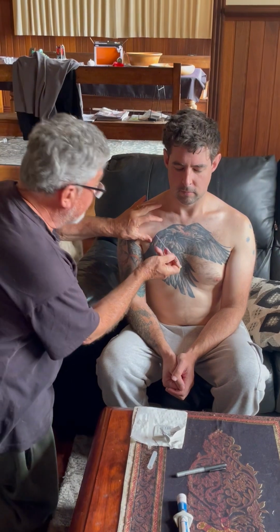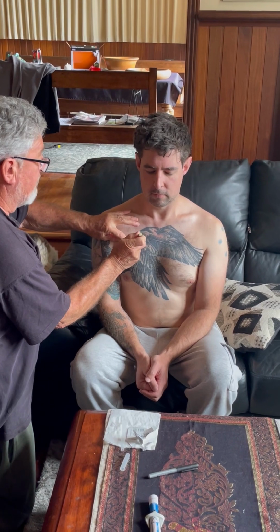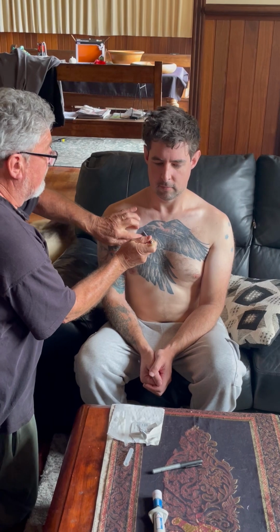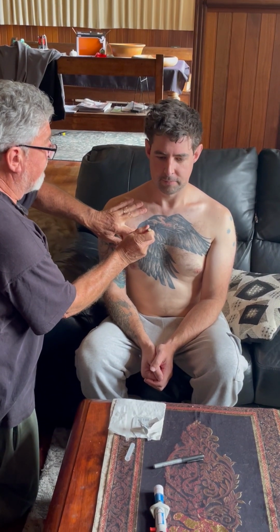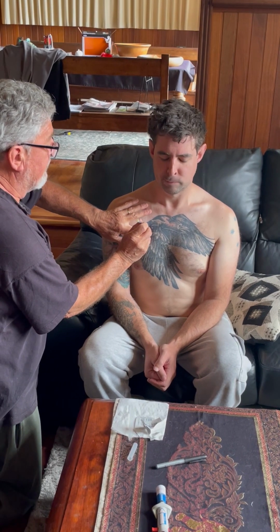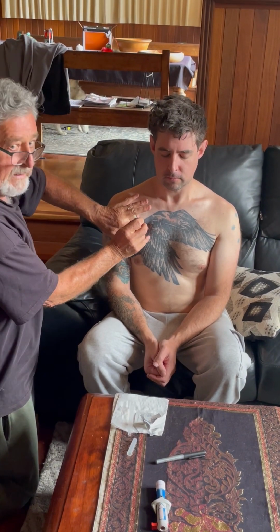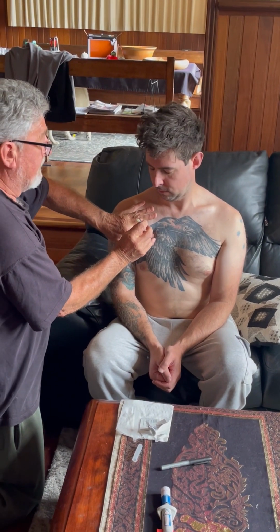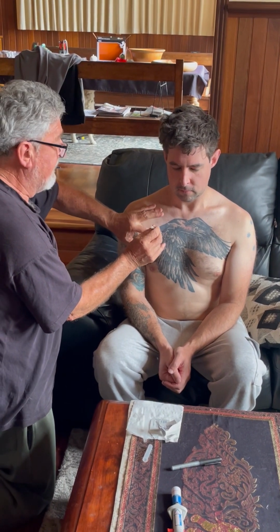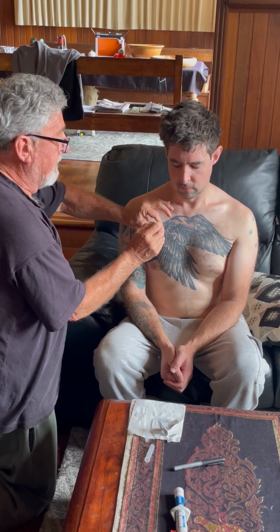So what we're trying to do now is identify where that mark is. We're going to insert the needle perpendicular to the chest, slightly above the third rib, and slightly towards the vertebral body. We insert that straight in until we feel a bit of a give or a bit of a pop, indicating that it's within the air cavity that is the tension. Once we've determined that, we can take the needle out.